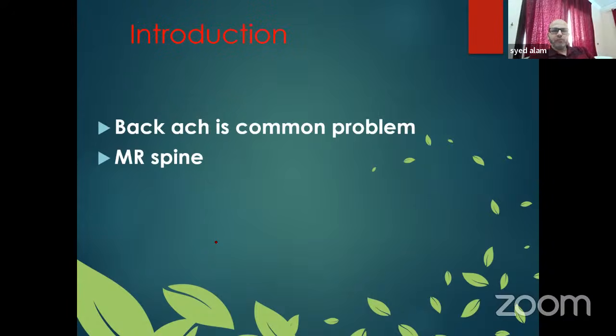Back pain is quite common, and we are doing a lot of MRI. MRI is the gold standard, and most of the clinicians have good knowledge about MRI spine. That's why I thought to discuss MRI spine. Those who are in the early phase of MRI learning, this lecture will be good for them.